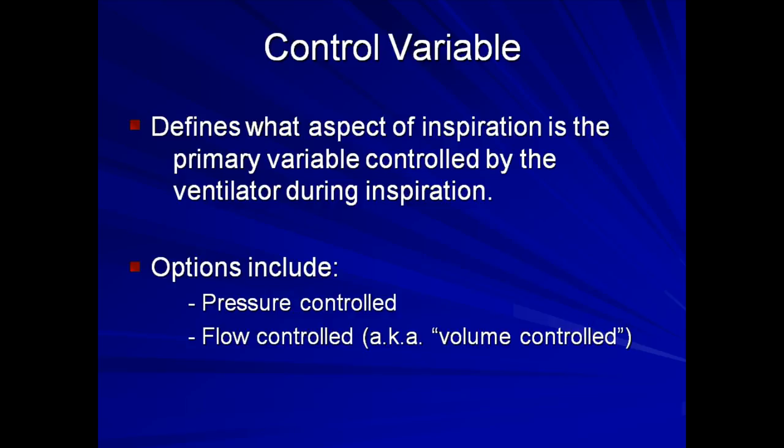In flow-controlled ventilation, the flow is controlled as a function of the preset tidal volume and the additional designation of flow pattern. Flow pattern, also known as flow contour, will be discussed later in this lecture as well as in lecture 8. If flow is predetermined, changes in resistance or compliance result in changes in airway pressures.